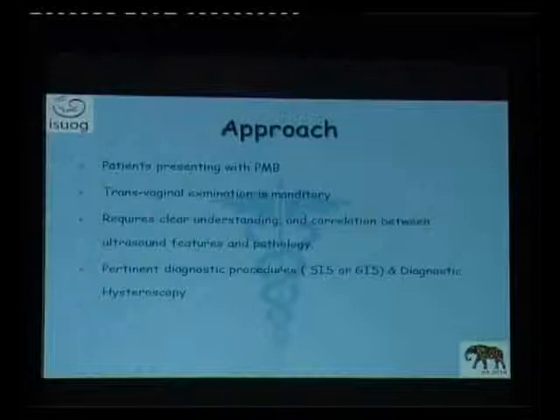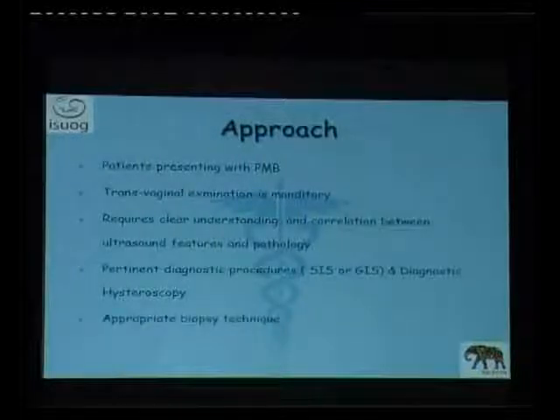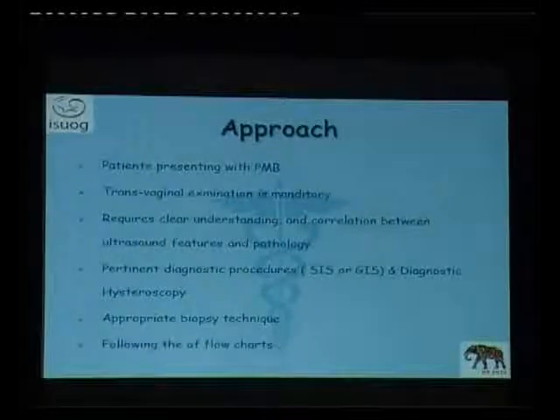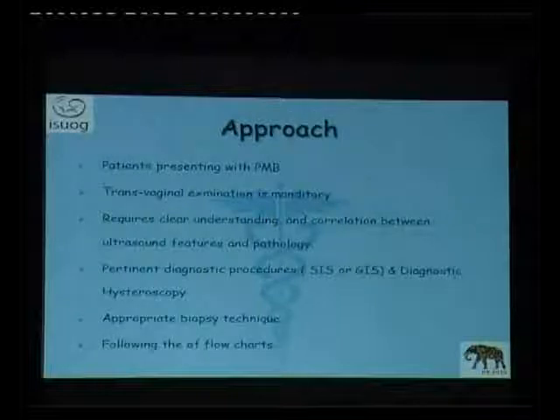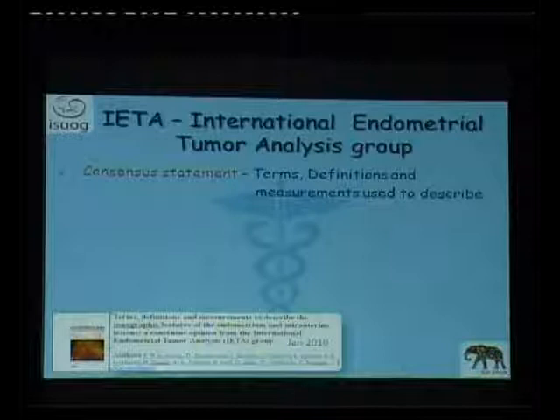Pertinent diagnostic tests such as saline infusion sonography or gel instillation sonography, or diagnostic hysteroscopy, have to be done, and appropriate biopsy techniques should be followed. Flow charts are extremely important and are going to be extremely useful. As I take you through the talk, I'll show you how important it is to go through the flow charts. Now, to make our lives much more comfortable, the IETA, that is the International Endometrial Tumor Analysis Group, published an article in 2010.